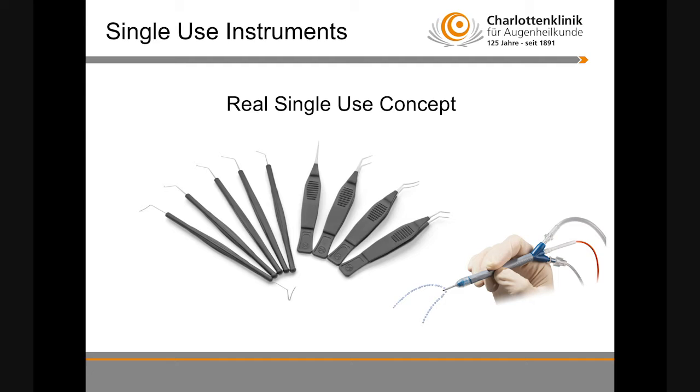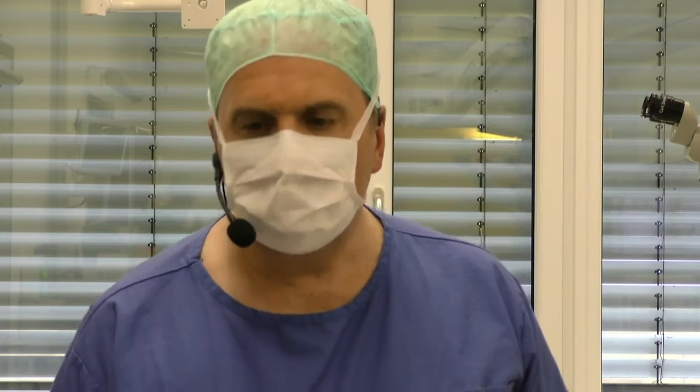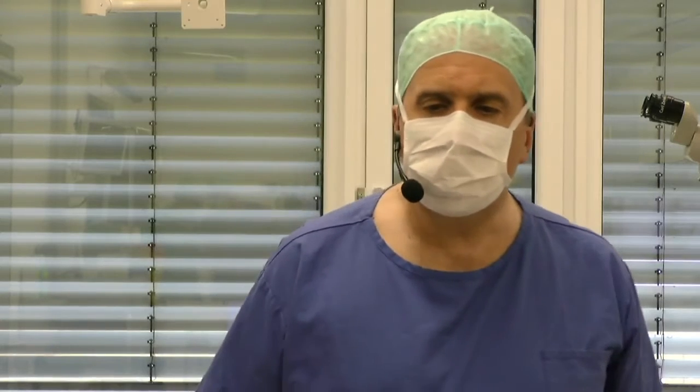There is no defect instrument or need for repair or whatever. You have 100% safety through the guaranteed sterility. You have an excellent performance with these new instruments. It's not always in every setting, but in our setting we have more cases through the single use and less cost. So I would like to introduce you now to the second patient.